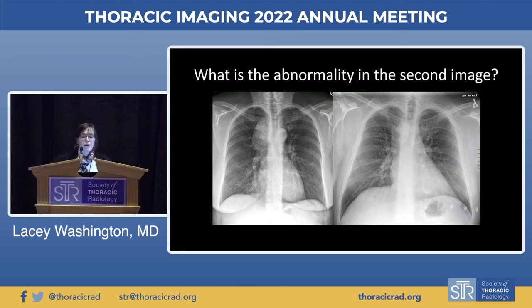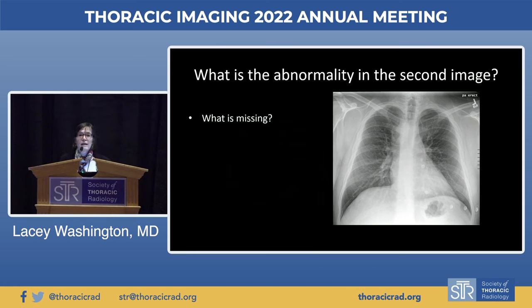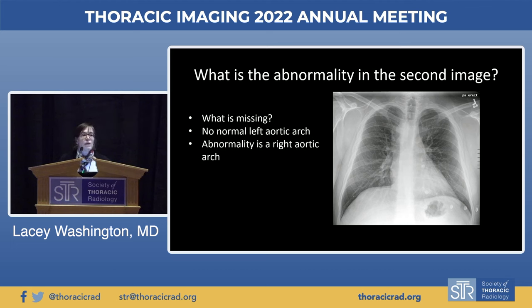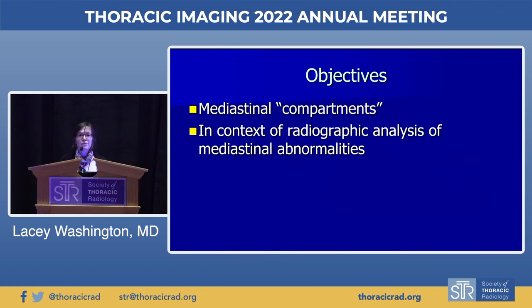But here's another case that looks pretty similar — a big right paratracheal opacity deviating the trachea to the left. Look around carefully: there's no normal left aortic arch. So in this case, we can look at the same kind of finding on a plain film and come up with a very specific differential diagnosis — a right-sided aortic arch — rather than a long list of possibilities.